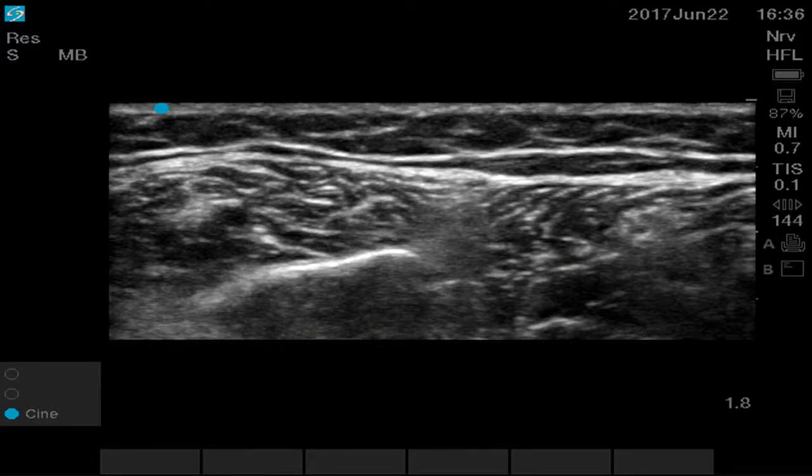Any doubts that I can answer? So the point is, I will always try to look at the reference point, not the nerves, because these are very small structures which you cannot track all the time. So I always try to relate the nerves to the reference points, either an artery or the bone. Only the superficial peroneal nerve lies between the two muscles.